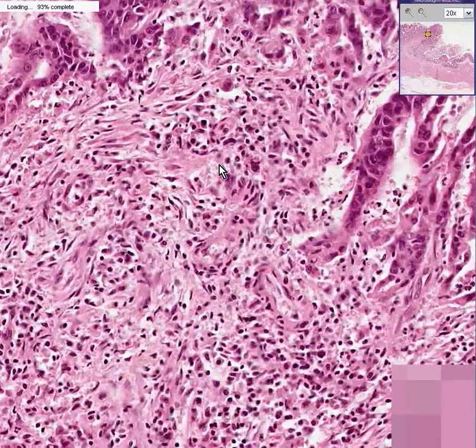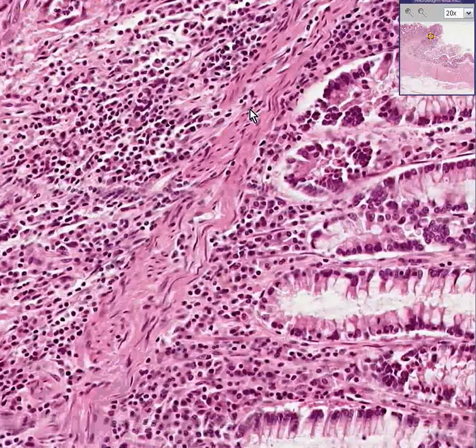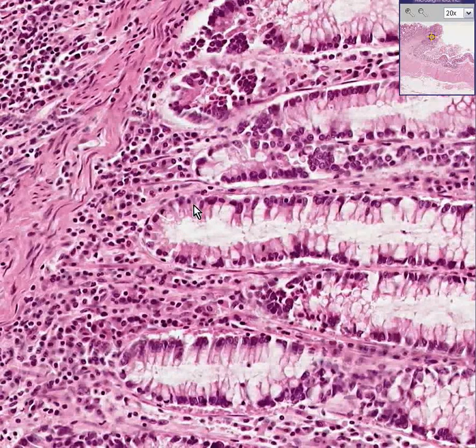However, when you go to the normal colonic glands for comparison, the ones that have not infiltrated the muscularis mucosae, notice how you see a nice mix with goblet cells. Notice how the nuclei are small. Notice how they stay towards the basal surface of the gland.